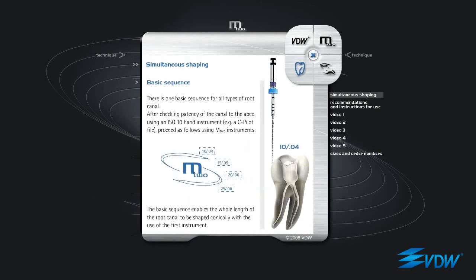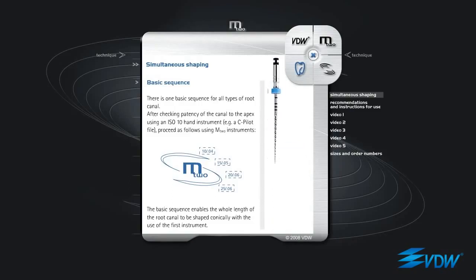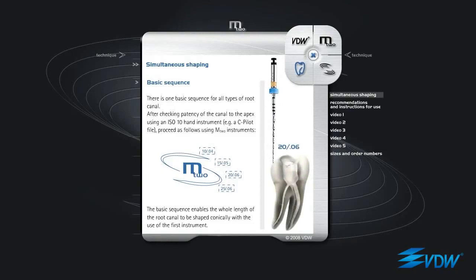Basic Sequence. There is one basic sequence for all types of root canal. After checking patency of the canal to the apex using an ISO 10 hand instrument, for example a C pilot file, proceed as follows using M2 instruments: M2 ISO 10 taper 04, M2 ISO 15 taper 05, M2 ISO 20 taper 06, M2 ISO 25 taper 06. The basic sequence enables the whole length of the root canal to be shaped conically with the use of the first instrument.